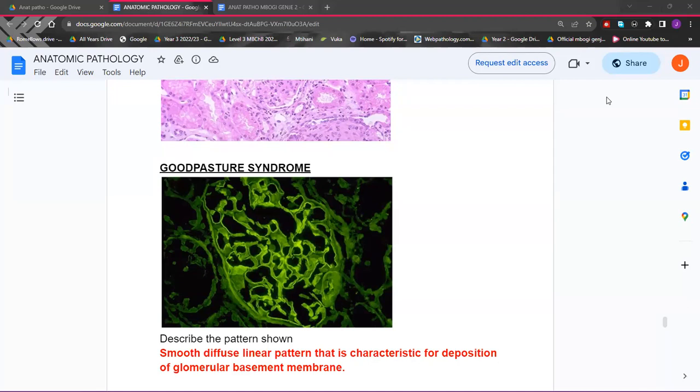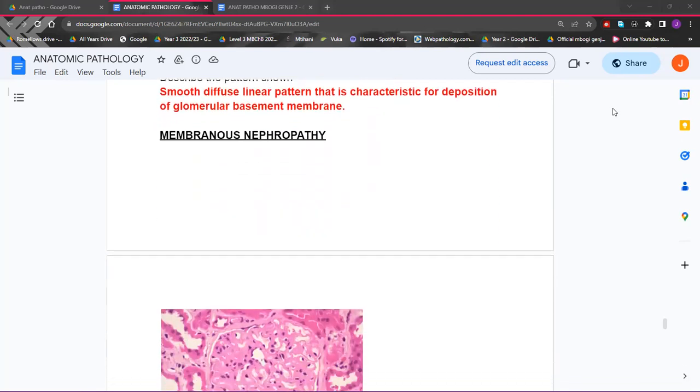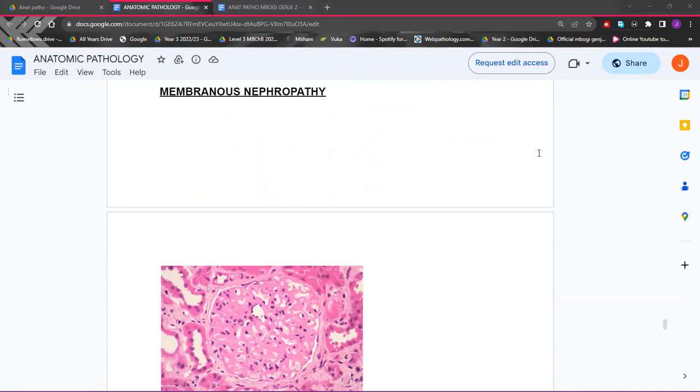In the presence of all these cells, it will lead to expansion of the normally thin layer of cells into the thick, characteristic crescent moon shape. So basically, you have damage to this membrane, it becomes more permeable, all these substances enter, and then its characteristic shape will change from thin to thick. And then under immunofluorescence, you'll have this linear pattern. That's a better explanation. Can we move to the next image? Any questions? Okay.